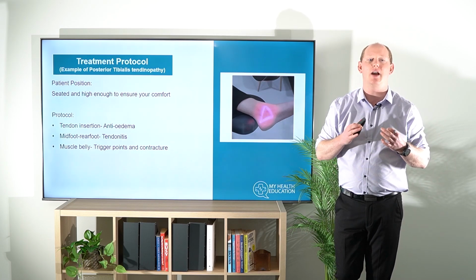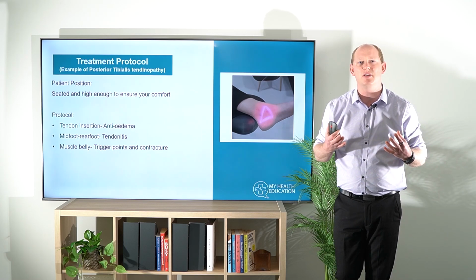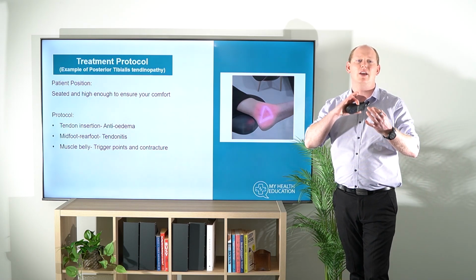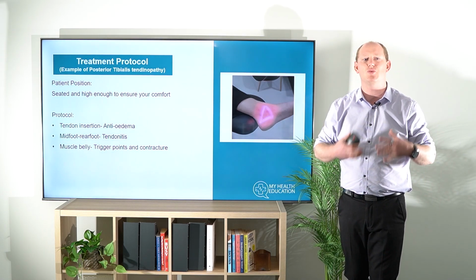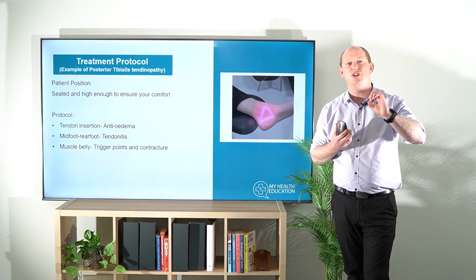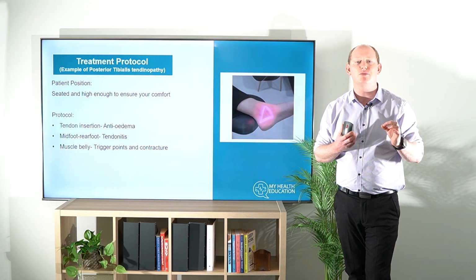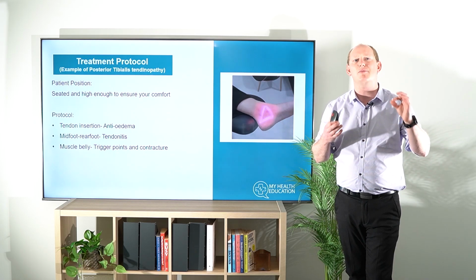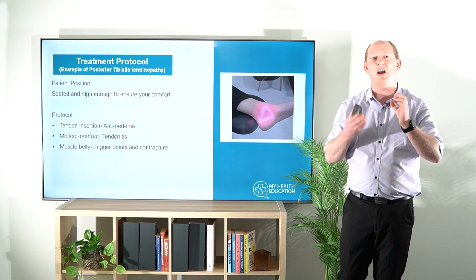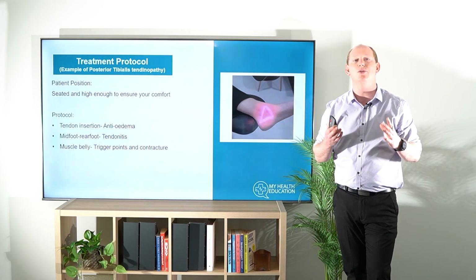When we're looking at what I'm going to be doing around each area, I'm really wanting to reduce any edema, and in the case of this one, this is a post-surgical patient that we've got here that has some recalcitrant swelling there, and so putting some anti-edema. And if you're finding that swelling, or there's effusions off the tendon, or there's some concerns there, you may need to go more proximal, around the malleolus or wherever that might be. Maybe it's the peroneus longus and you need to make sure that, okay, well, actually we're really at that plantolateral border. So start considering a bit more broadly what we're looking at.